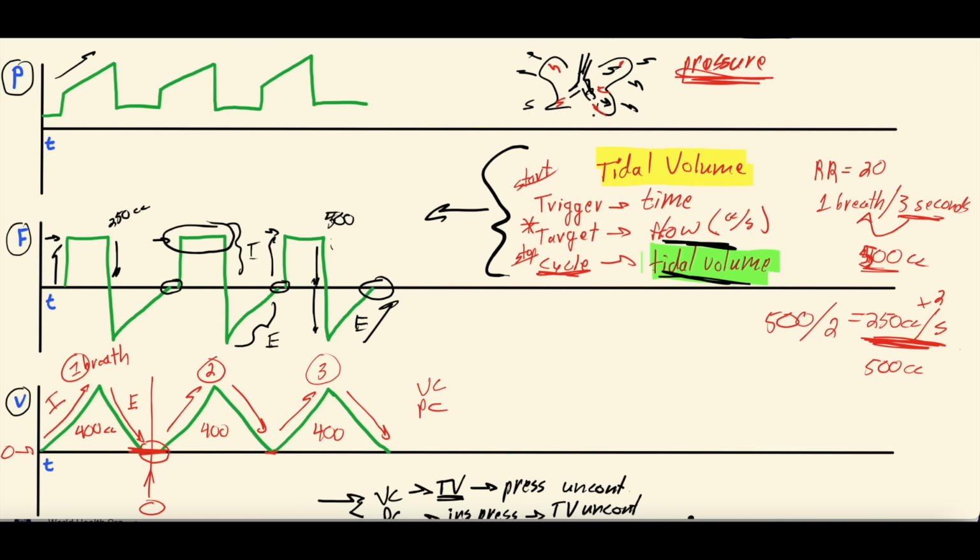But when you set a set flow rate, that's going to slowly, as it flows air down and pushes those lungs out, build up an increasing pressure as more air is delivered into the lungs until you get to that point where the breath is done. You can see these line up, right? Breath is done, at which point the patient expires and the pressure drops back down to this set pressure, which, if you watched our original video, is the PEEP, the positive end-expiratory pressure, which we won't go into here. Definitely check out that other video.